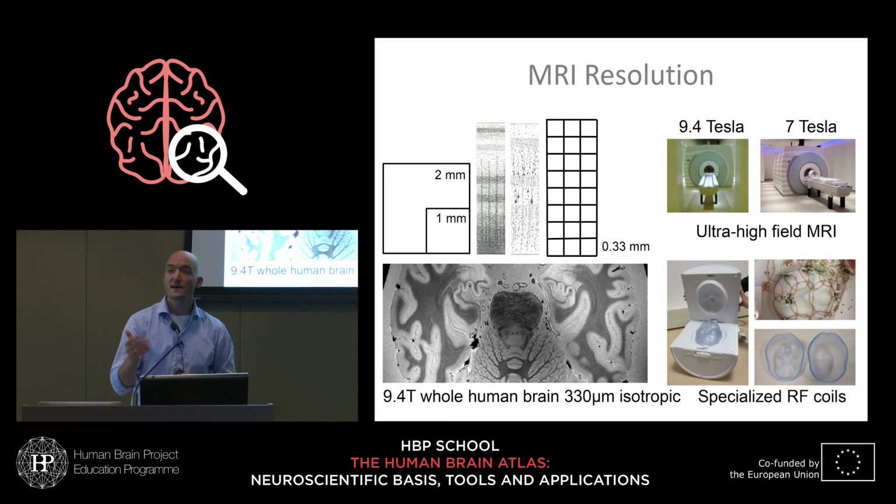Another downside that you might mention is not so much a downside as a consideration that you have to take into account. Once you get this kind of data, you can't say, oh, now my job is done, I plug it into my standard pipelines, my Brain Voyager, my FSL, or my FreeSurfer, and now I will immediately get my benefits. No, then you work very hard on changing all of your analysis pipelines. For one thing, to even load these images, because they're not used to that. The first thing that will tell you is memory error. We can't load an image that is 4 gigabytes, right? So you have to work very hard at every step of your analysis to make it work as well.